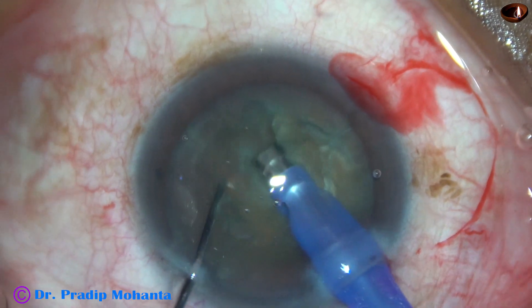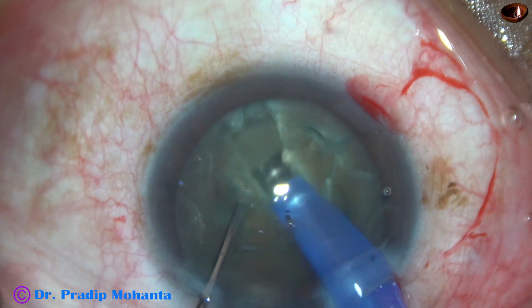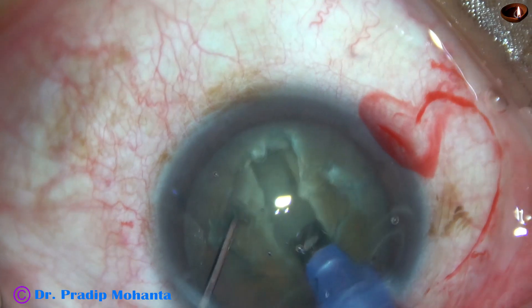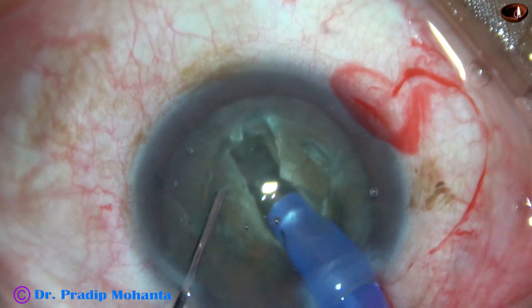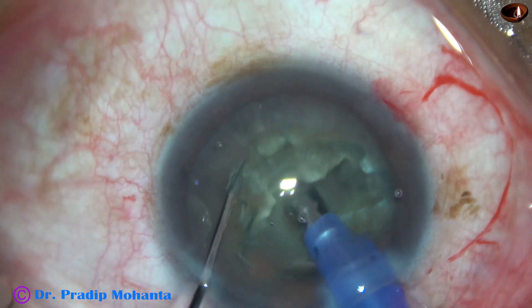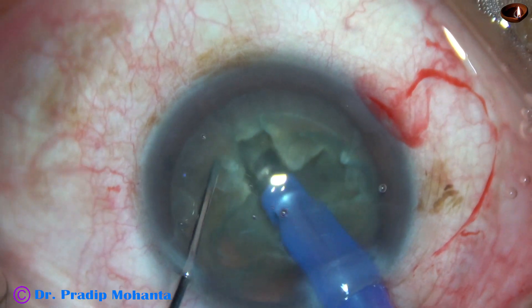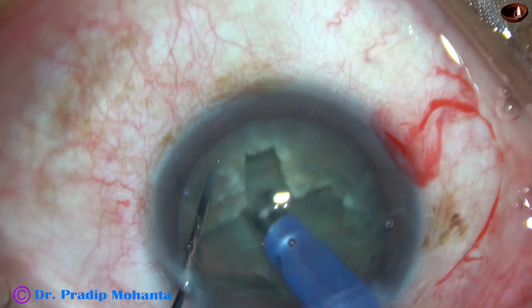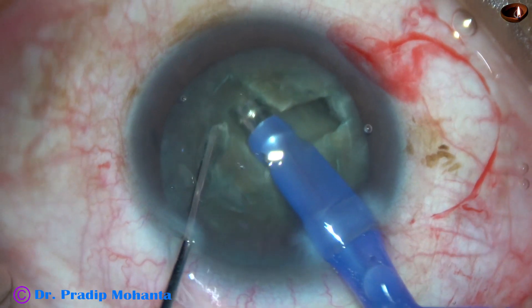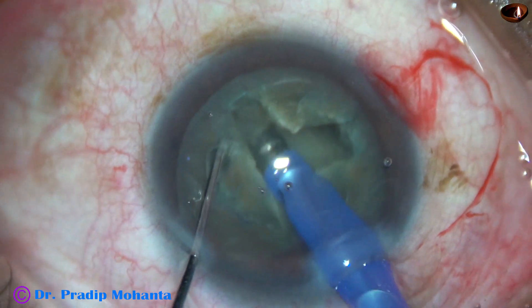Ultrasonic energy is 70%, flow rate is 20, and vacuum is 80 mm of mercury. There is a little cut on the wall at the central part so that you can easily go into the center. Now this is another trench 90 degrees away from the initial trench. In this case, my plan is to make a plus sign, and the groove should be of such depth that the tip almost sinks into the groove.